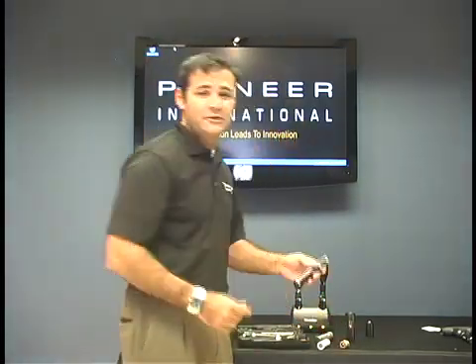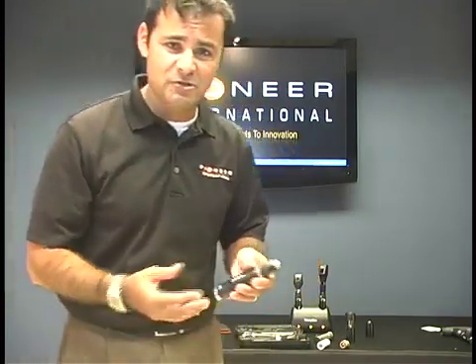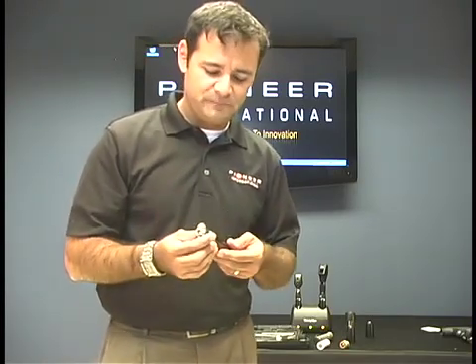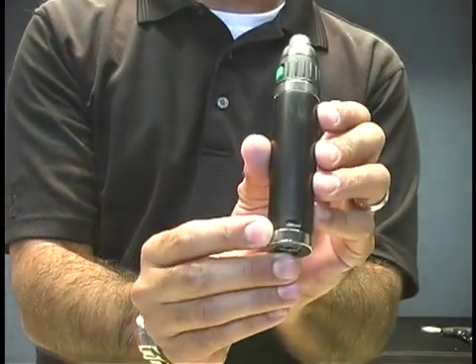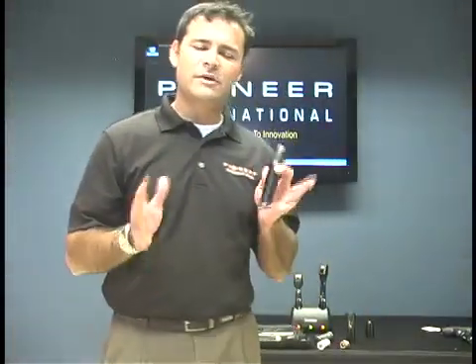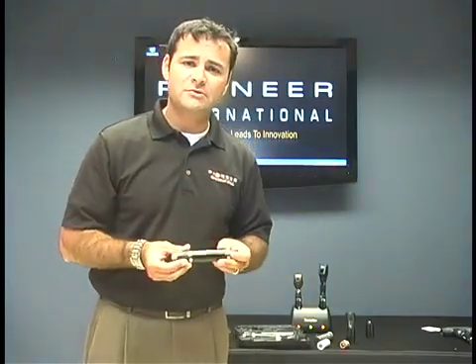Now let's talk about the lithium ion — this happens to be the market leader. It uses lithium ion technology, similar to what's in phones and other devices. What's really nice is that when you're in the back of the eye and looking, there's a little line here that will turn bright orange. This bright orange is our low battery indicator, letting you know you've got 5 or 10 minutes of on time, depending on how high you have the rheostat turned up.